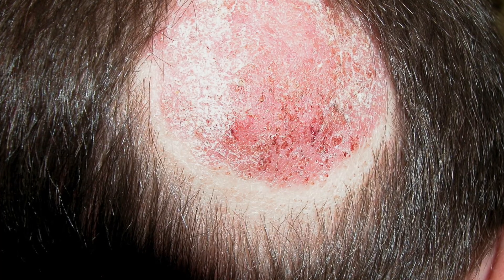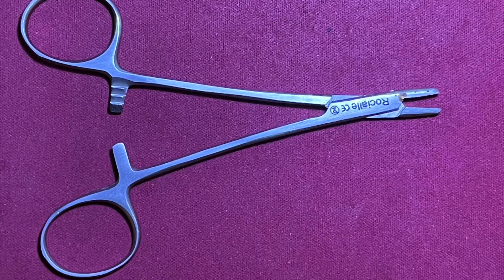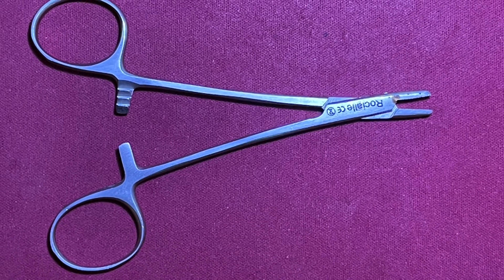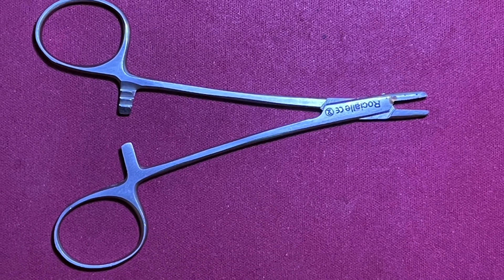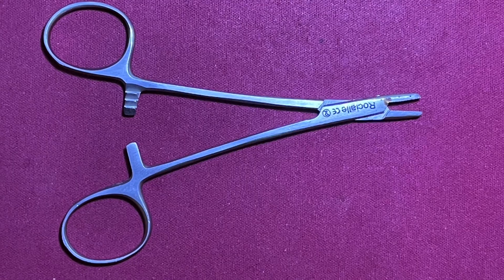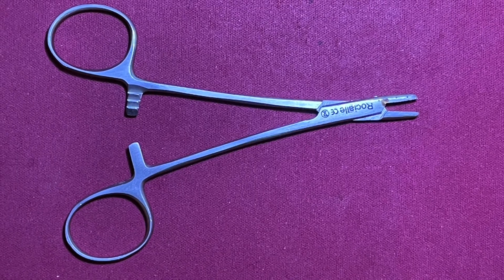If the affected areas show short infected hairs, these can be removed by pulling them out using a pair of forceps. To improve the grip, it can be helpful to apply small plastic bands around the jaws of the forceps, which improves their purchase.